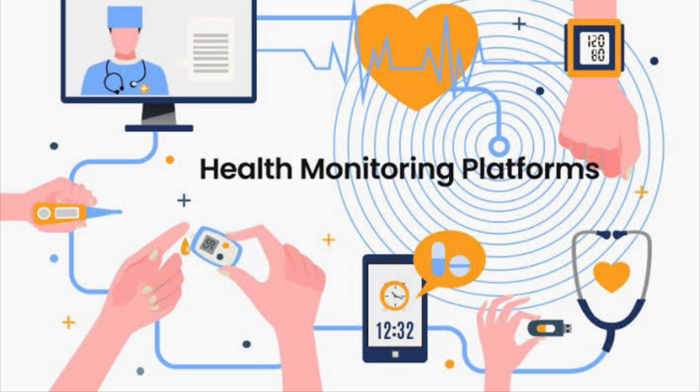In an ideal scenario, the monitoring data should be reviewed in a hospital command center, which is becoming popular. It's like a NASA space station control room where a lot of people sit, but more importantly, a lot of monitors show all these, and artificial intelligence and machine learning algorithms will read this and give alarms accordingly. So this is monitored in person by people who are qualified to do that, and actions are taken appropriately. So this is one of the crucial steps: what you do with the data, what software is to be used, what technology is to be used, what the manpower is, and what the location is where this is going to be monitored.